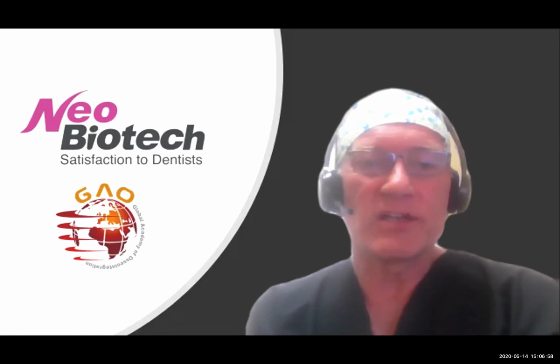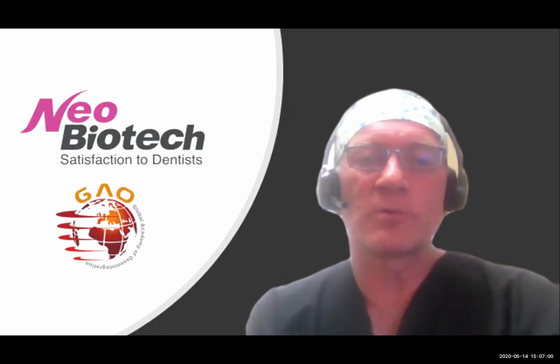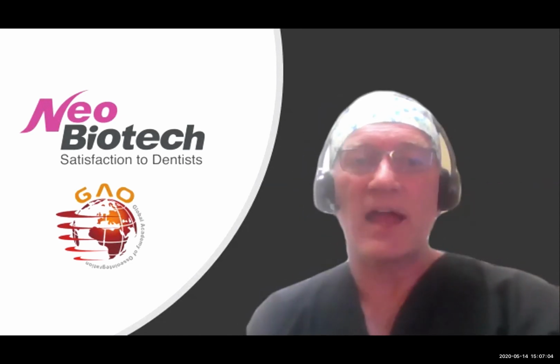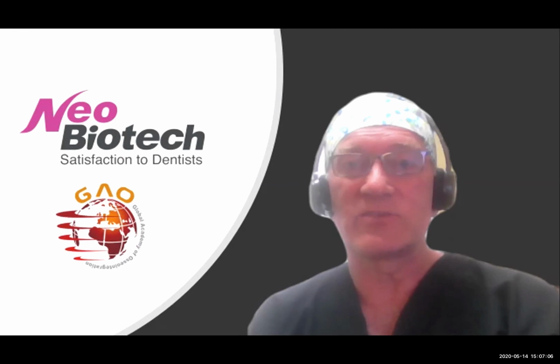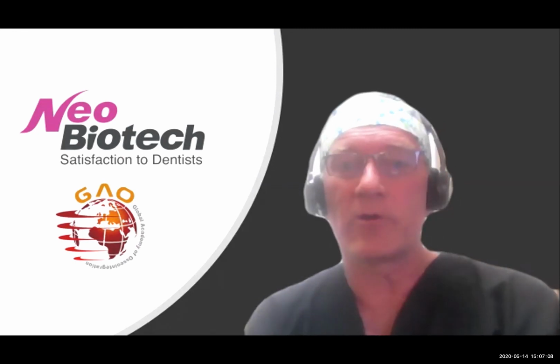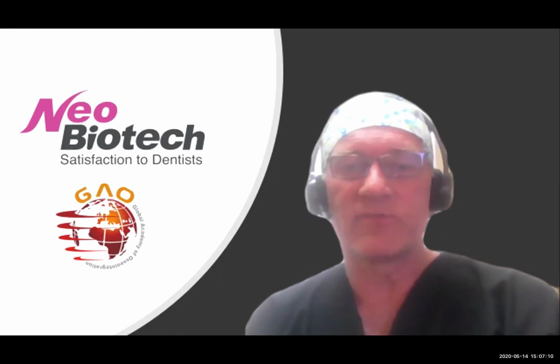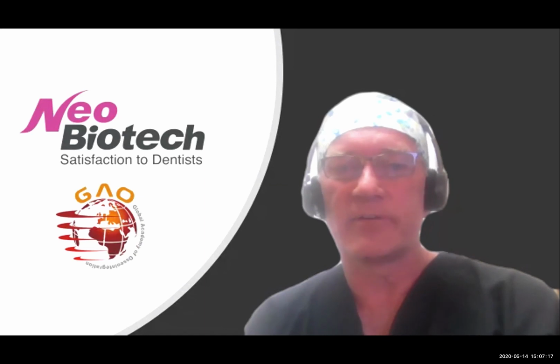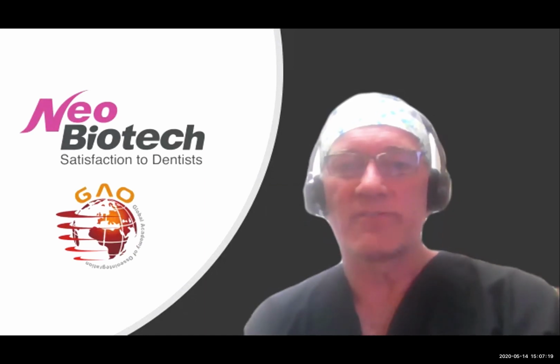Next question by Justin is, which type of bone graft do you prefer for the tunnel technique? The majority of bone that I use, Justin, is now a cortical powder for everything. I use that for my extraction socket preservation, for my sinus, and for the tunnel technique.